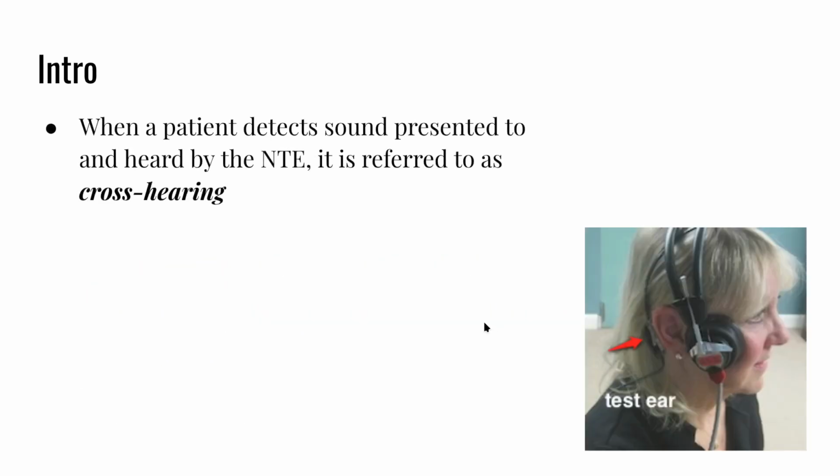When a patient detects sound presented and heard by the non-test ear, it is referred to as cross-hearing.